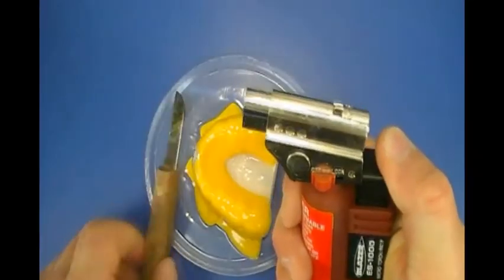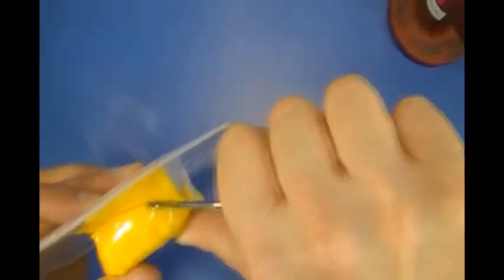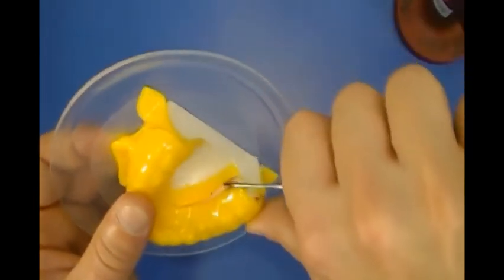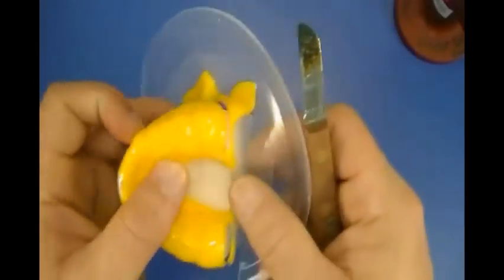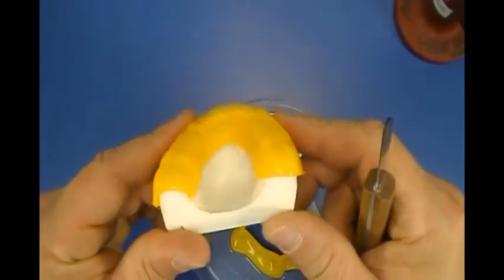A rough cut out of the mouth guard is done using a torch and a lab knife. Heat the knife to cut through the mouth guard material. Cut along the tissue anatomy at the model base and a few millimeters behind the last tooth in the arch. Also cut about 5mm below the gingival margins in the palate.